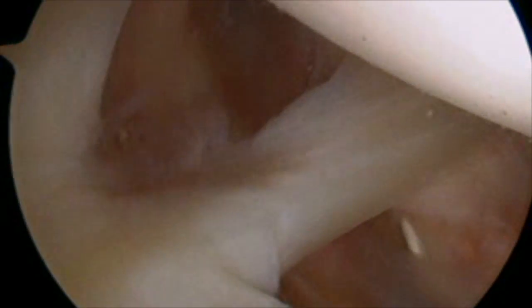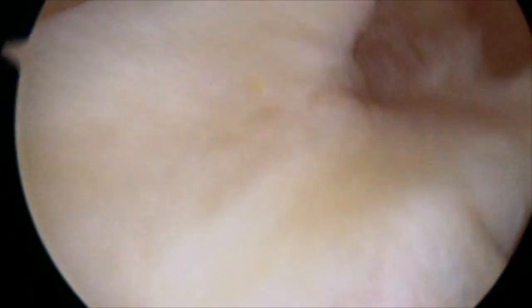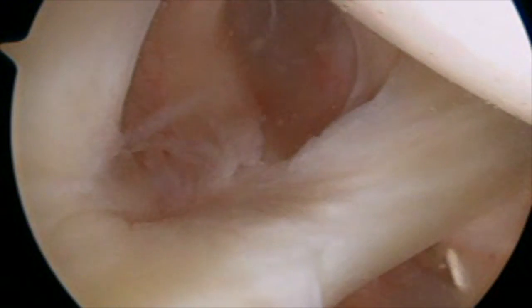First, I'm going to run through the video quick. This is real-time, kind of the initial tour, going in to the back of the shoulder, taking a quick peek. And once we take our quick peek, that's when we come around to the front — called the rotator interval — and establish a second portal, which will allow us to put instruments into the joint.